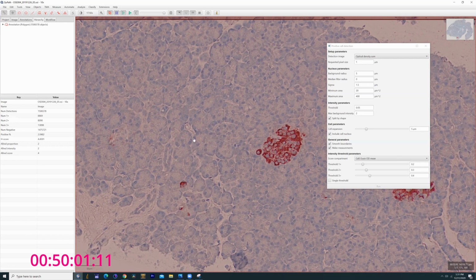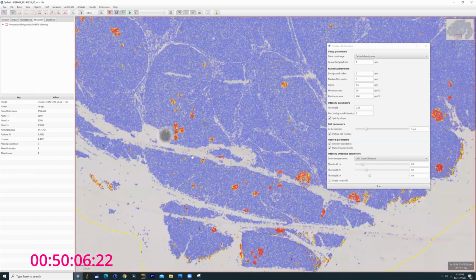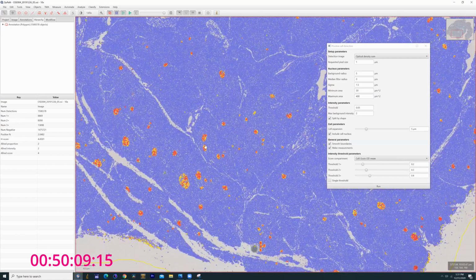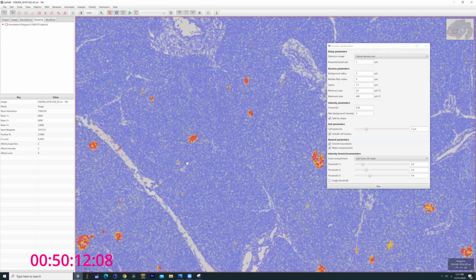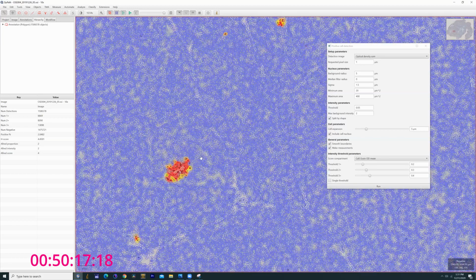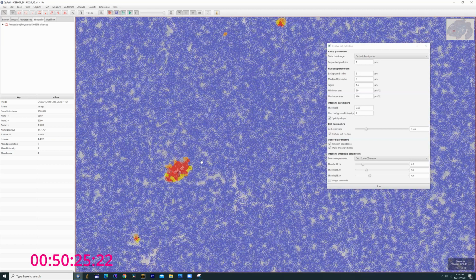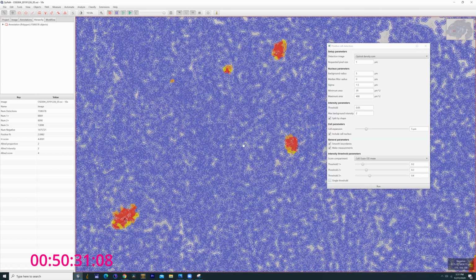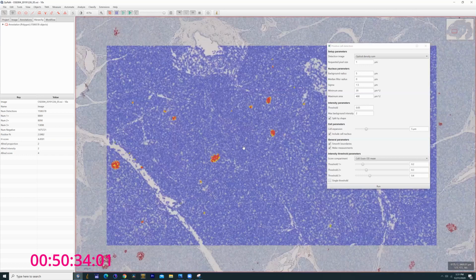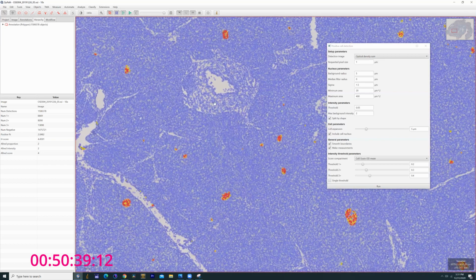So once this flatlines, I'll show you guys where the raw data is, and we'll go from there. And as you can see, it's, again, keys here. You have D, which removes all the labeling. You have F, which fills, and it's nice for getting rough surface areas, kind of getting rid of that background. As you can see, it does get a little busy. And there's actually ways in the software to map.